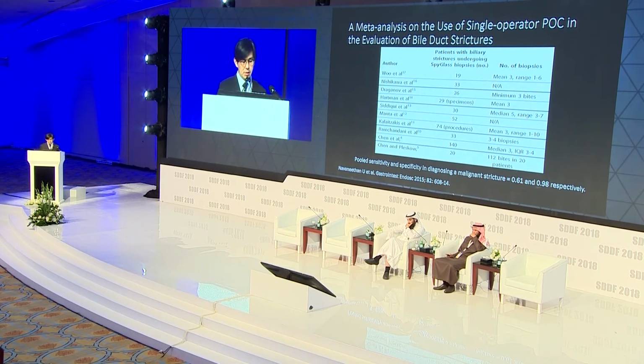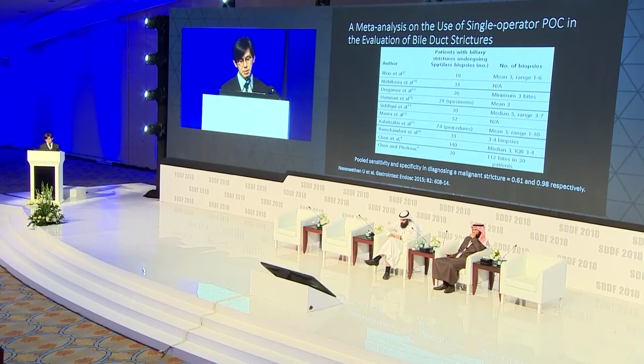So the University of Florida group performed this meta-analysis over the use of single-operator POC in the evaluation of bile duct strictures. And the group actually pulled all the studies together, and admittedly, some of the studies included the earlier generation SpyScope that use optical fibers. But I think the message to come away with from this analysis is that the sensitivity in diagnosing malignant stricture using POC is in fact not that good, 61%.